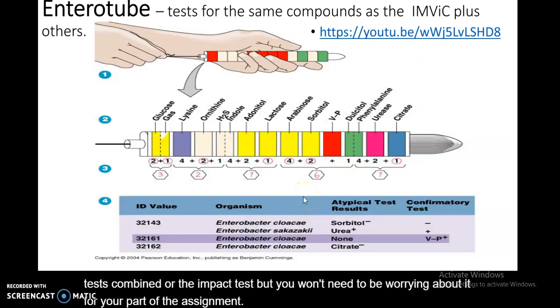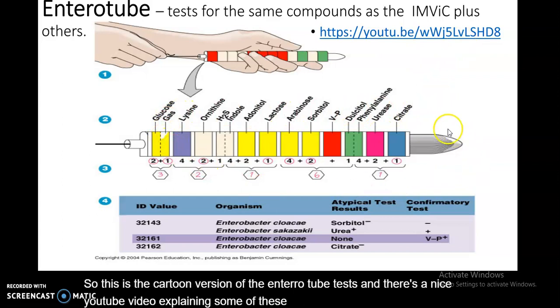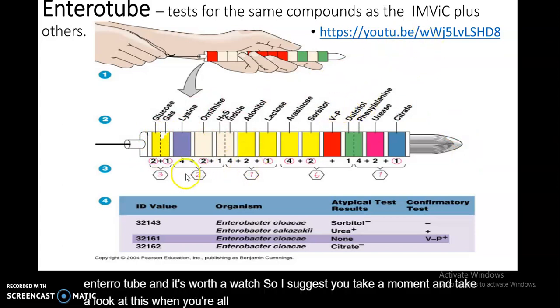So this is a cartoon version of the Enterotube test, and there's a nice YouTube video explaining some of these tests and how you inoculate an Enterotube. And it's worth a watch, so I suggest you take a moment and take a look at this when you're all done with this video.